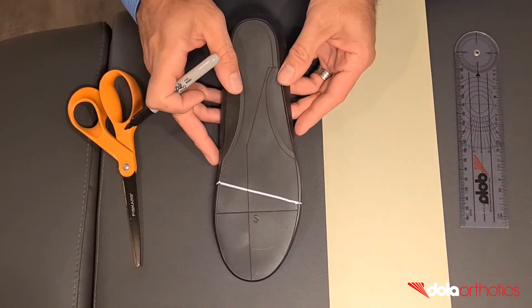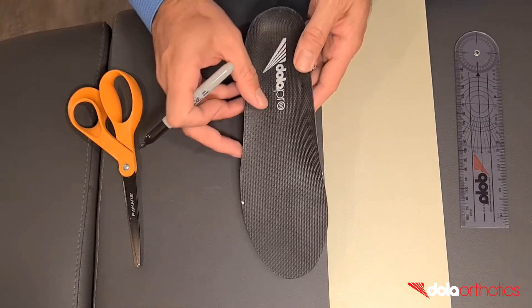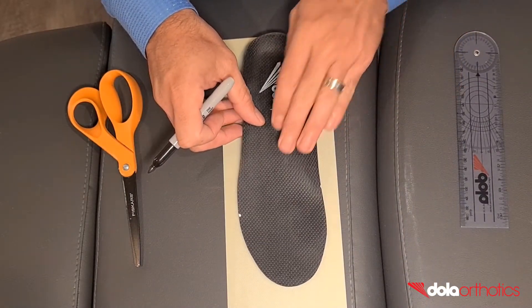For this addition you will need a marker pen, ruler, Dollar Tech plate sheet, glue, scissors, and a grinder.